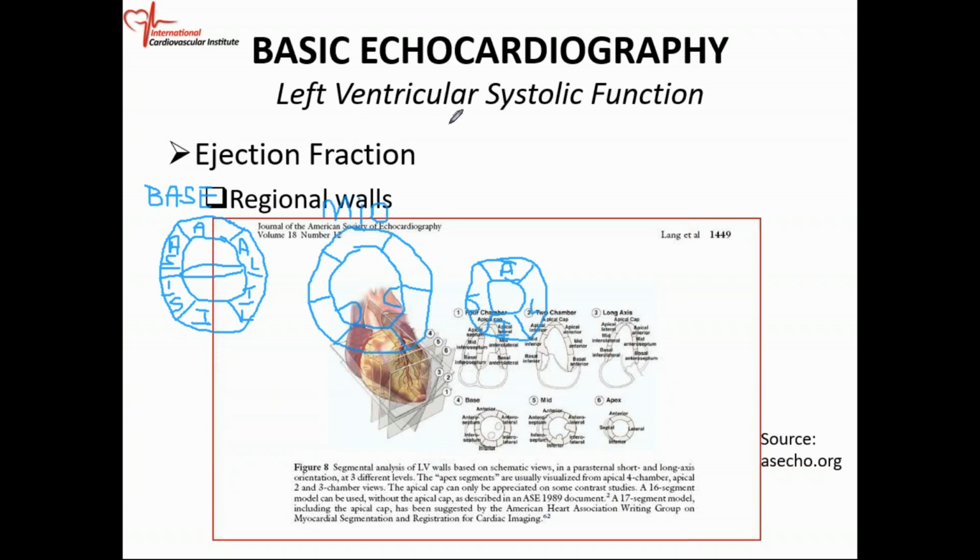So remember what your apical 4-chamber view looks like, and let's see if we can draw that. So your apical 4-chamber view, okay.